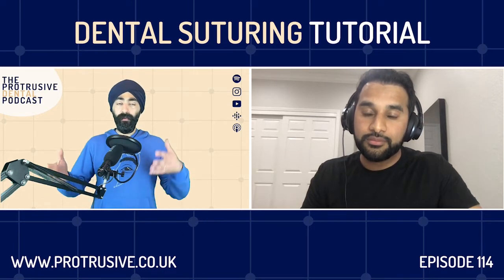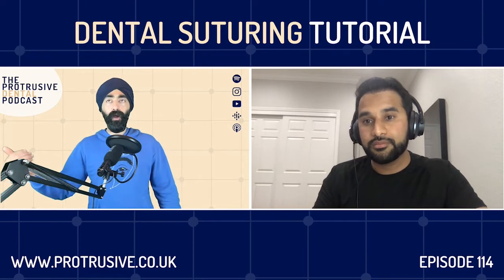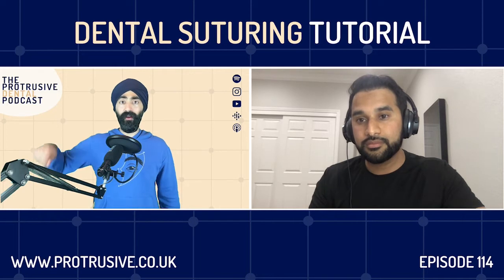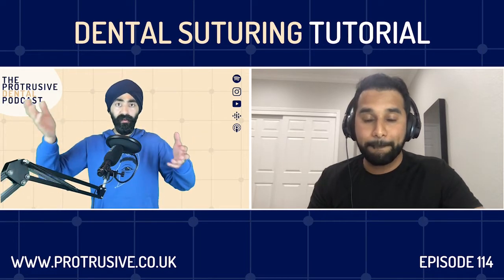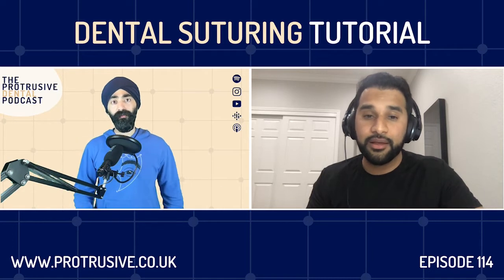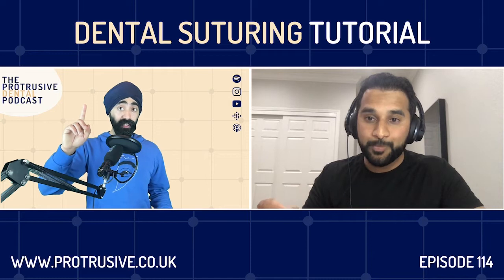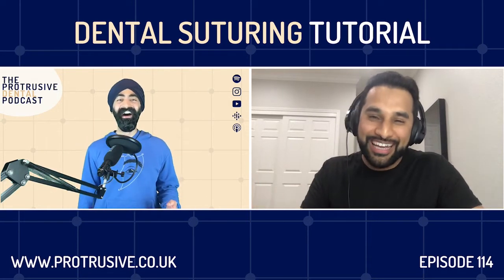And previously, now that we're talking numbers and throws, from the background I come from, the way I was taught was 2 in one direction, 1 in the other direction, and then 1 again in the opposite direction. Is that acceptable? Because I know there's so many variations. Is that okay? Yeah, that's fine. Sometimes. But is that the Nabeel Cajee way? Yeah, you saw I was like, yeah, you can do that.